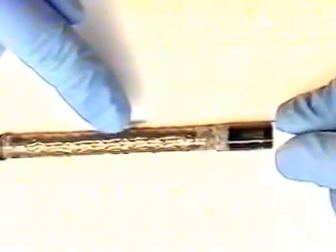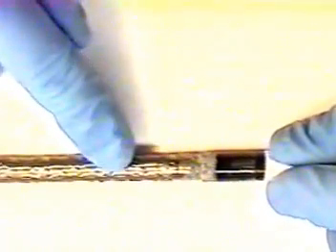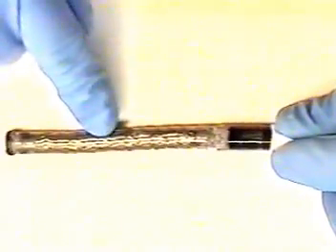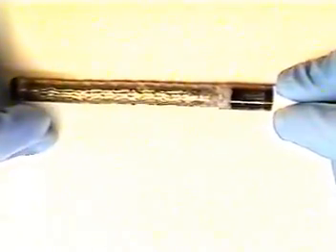Before we can proceed with replacing the bending rubber sheath, be absolutely sure that there is positively no moisture, either water or cleaning fluid, internally in the bending section mesh. The easiest way to do that is to see underneath on a paper towel if you see any moisture.